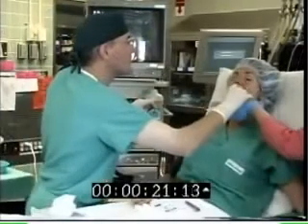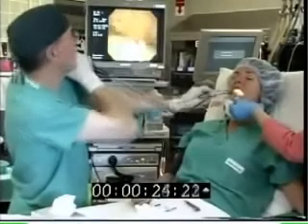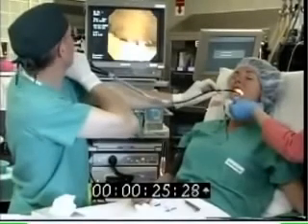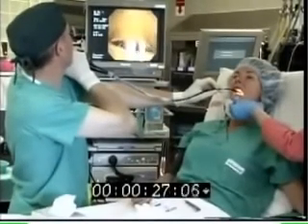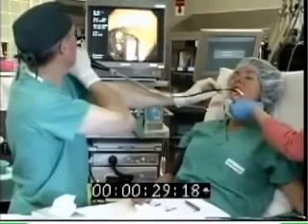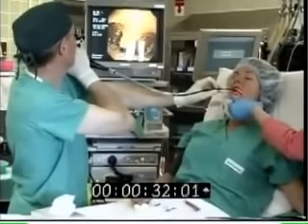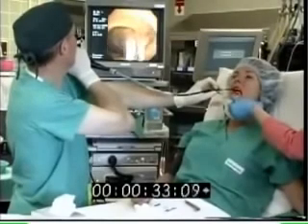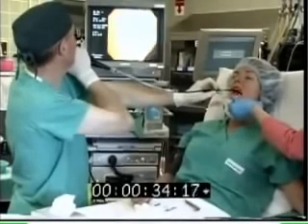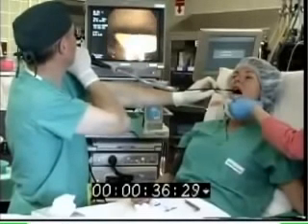To elevate the epiglottis, gentle tongue traction with a gauze is provided by an assistant. The scope is inserted into the oral cavity in the midline, and then advanced slowly over the tongue towards the uvula. Gently resting the hand holding the shaft of the scope on the patient's chin may help keep the scope in the midline. The scope is advanced past the uvula and flexed caudally to visualize the epiglottis.